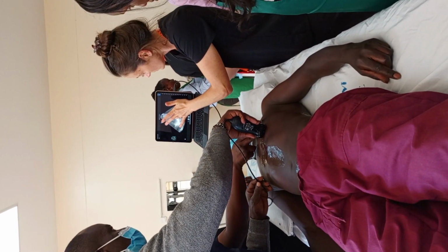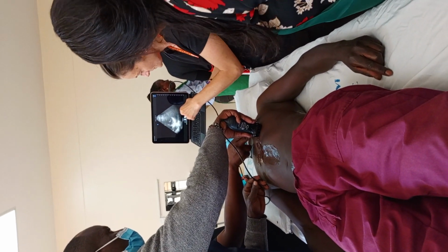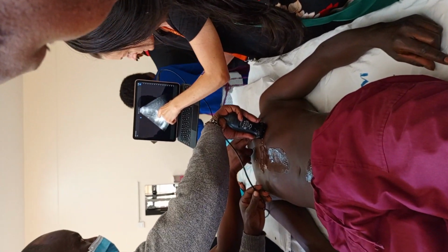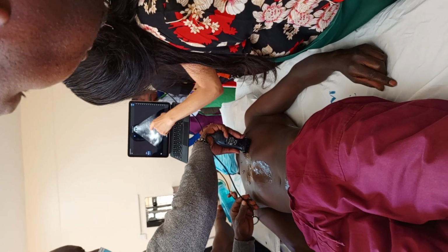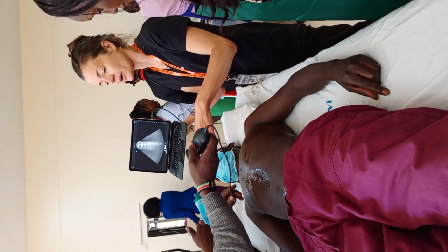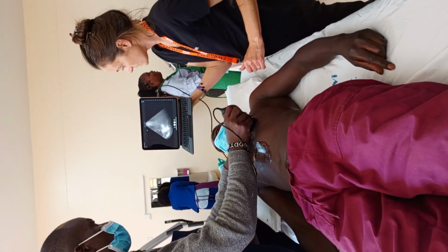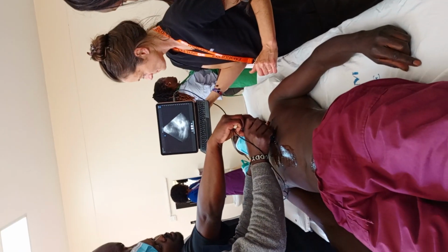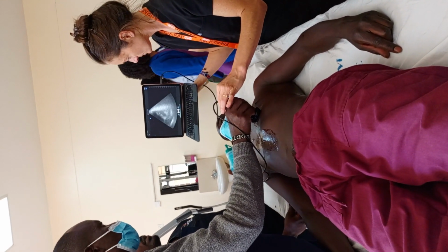There you go. All right. This is his left ventricle right here, because it's thicker, and you can see there's no free fluid outside in the pericardium, outside the heart. Okay. All right. So if you're having a hard time there, you can always look on the chest wall, anterior chest wall. So you adjust it, and you just twist this little piece around. You don't have to force it, just push down.